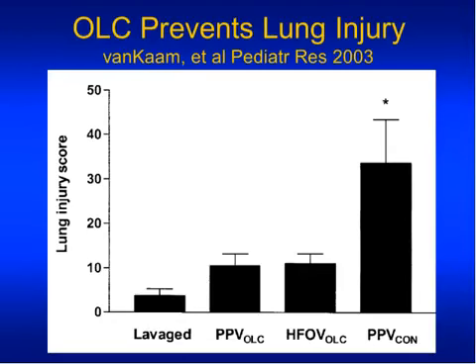The VN500 has an extremely effective leak compensation mechanism so that you can ventilate accurately with tidal volume measurements, still being accurate by correction based on this algorithm. That allows us to use accurate volume measurement and volume-targeted ventilation with leaks upwards of 70 or 80%, which is pretty remarkable. And so there's really virtually no circumstance where you cannot use volume guarantee.